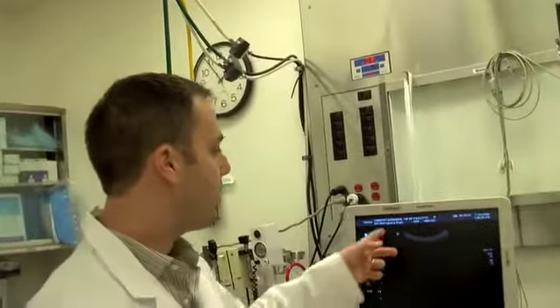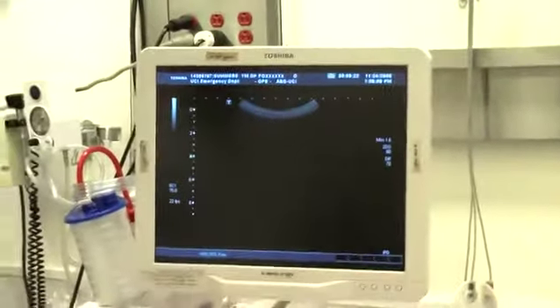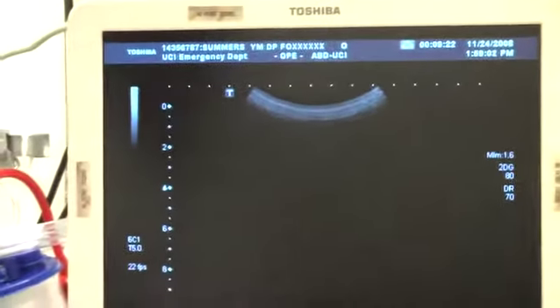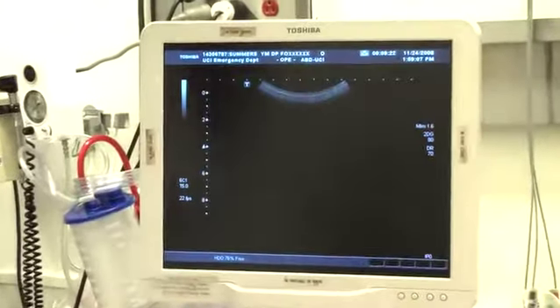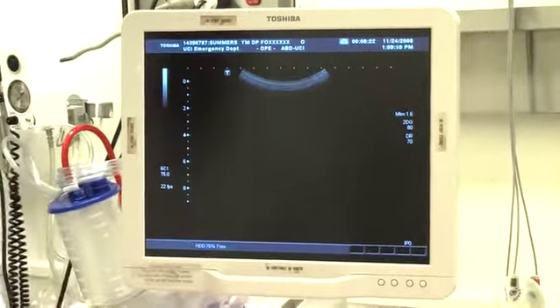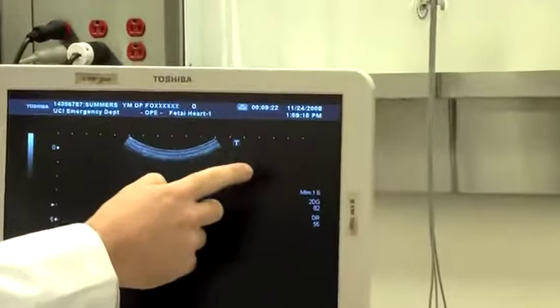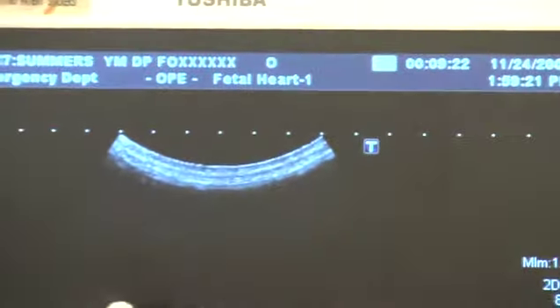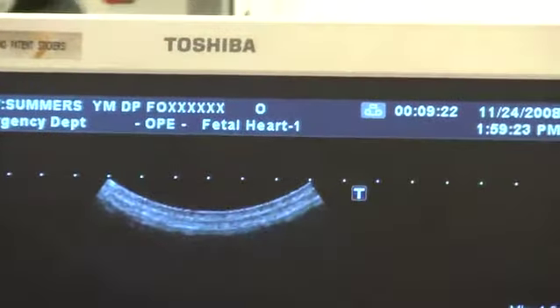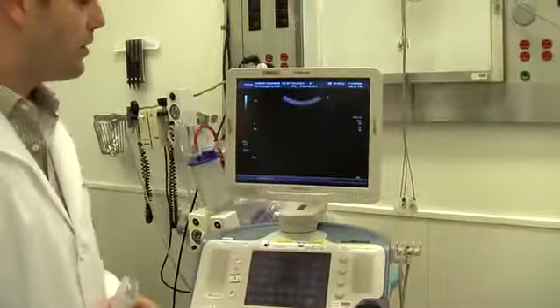When you go to your preset menu, there's a preset button down here, and you can choose your application. When you choose cardiac, it's going to completely switch the indicator over because the cardiologists like to be all cattywampus and go against the radiology world. So the preset for cardiology puts the indicator to the upper right-hand corner of the screen, which makes everything backwards for our purposes. So Dr. Fox was indeed correct, actually. If the indicator is in the upper right-hand corner of the screen, then your indicator on the probe should be to the patient's right shoulder.